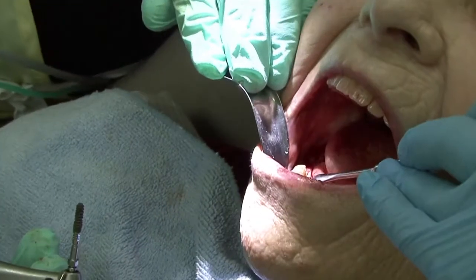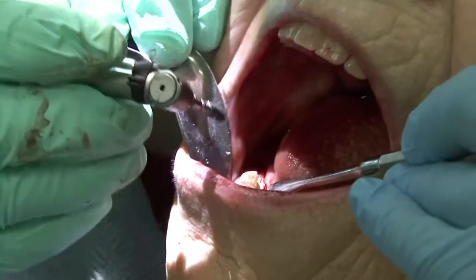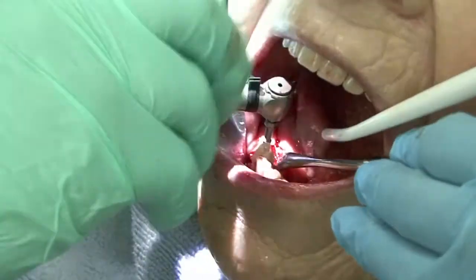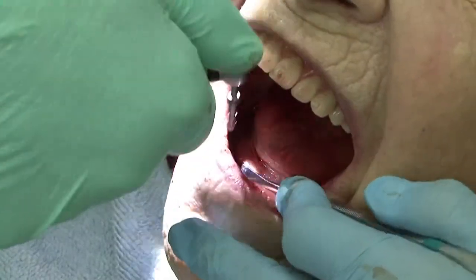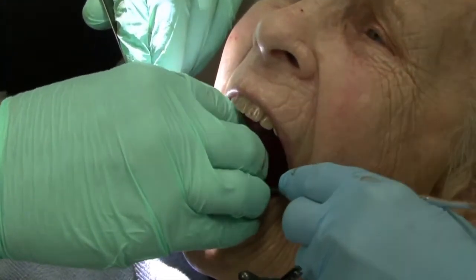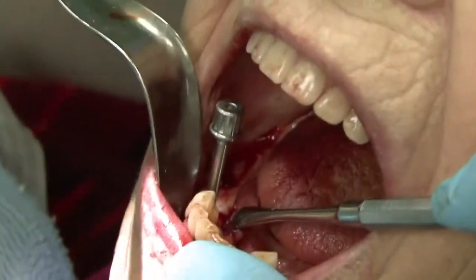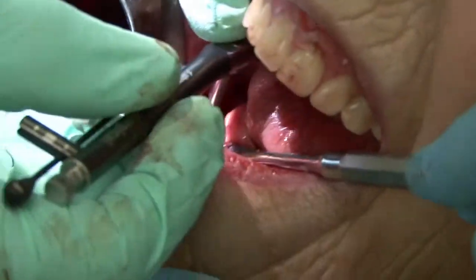We're going to spin at 15 RPM, which is much lower than normal, but you have to keep the drill spinning low when you start. And we're about halfway in, and it's time to ratchet. It won't go any further. So now we're going to use the ratchet from the hand instrument kit. It's in place. We're going to apply our torque, and spin clockwise.